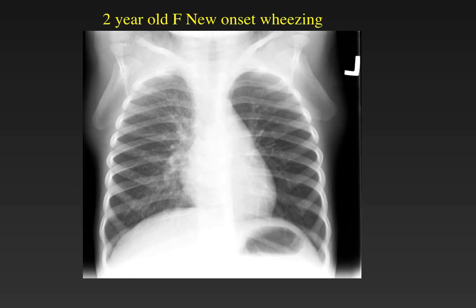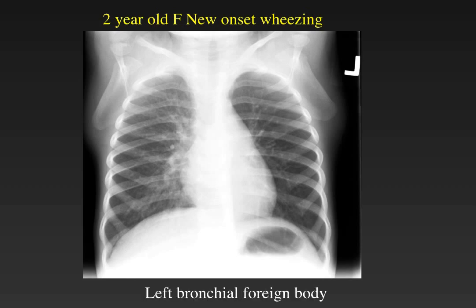Here is another child who presents with new-onset wheezing or stridor. As we look at the lungs, we can see an asymmetry in lucency with the left lung being more hyperinflated, more lucent, and showing decreased pulmonary vascularity compared to the right side. In this age group, we need to consider that there may be focal air trapping in the left lung in this child who aspirated a left bronchial foreign body.